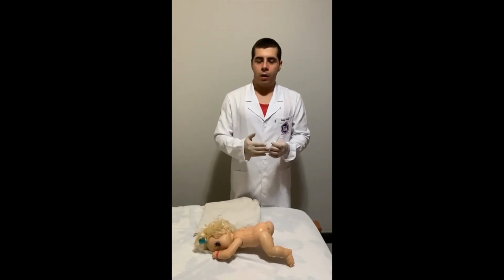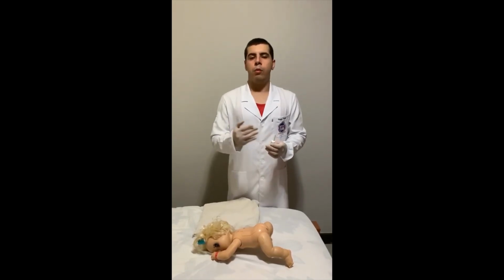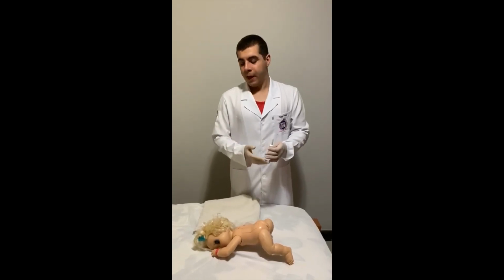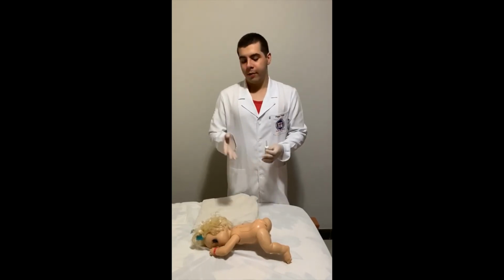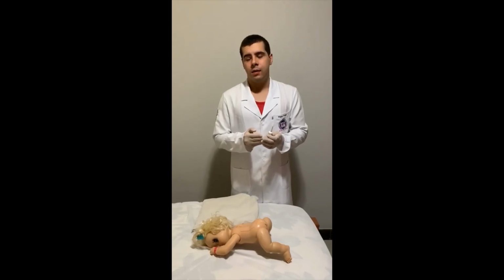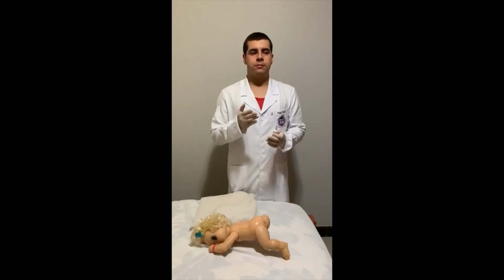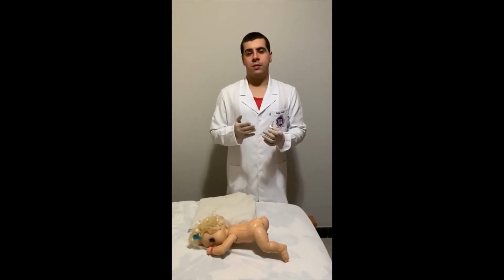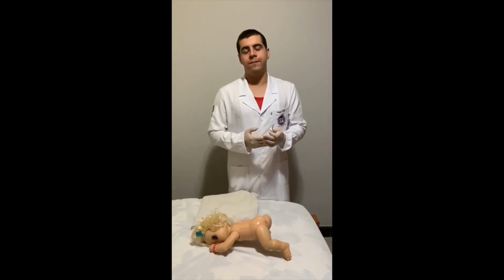Like now we will introduce the med. Now we will start the procedure. Now I'm recording your signs, and after the entire application, we will observe the signs, like if the patient is making a pain face, if the patient swells after the procedure, if the patient will have pain in the local, it's super necessary to observe.